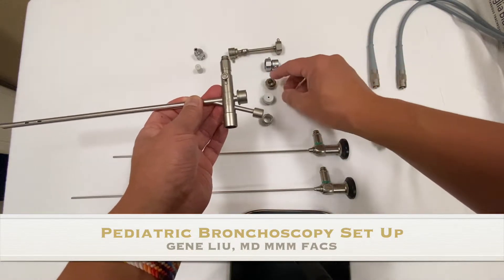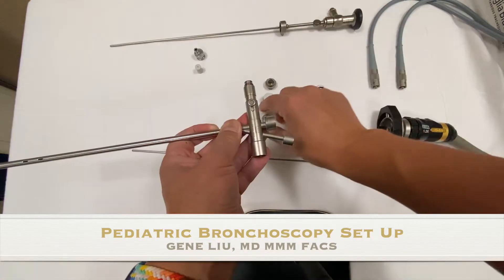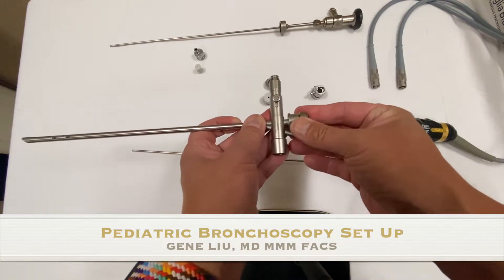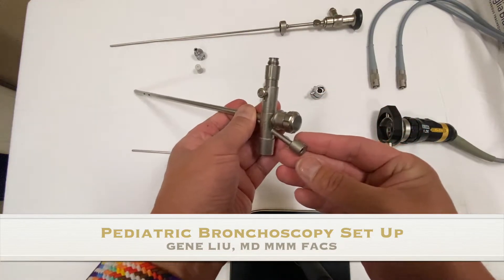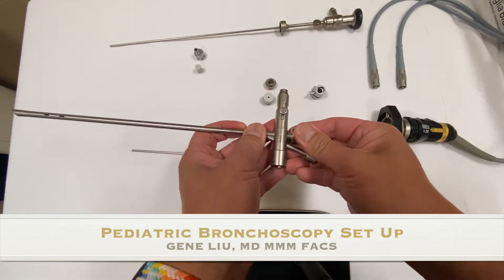There are a couple of other plugs that attach to the end of the bronchoscope and each serve a different purpose. The first is the window — it's completely covered in glass. When you put it on it's a closed circuit, so it allows you to fully ventilate in and out. But to visualize you have to look with your eyeball through the glass.